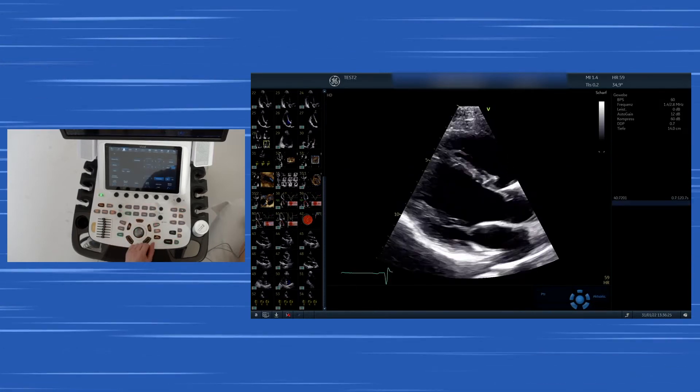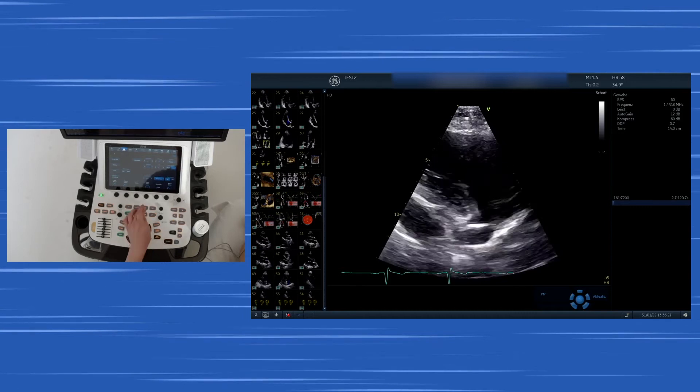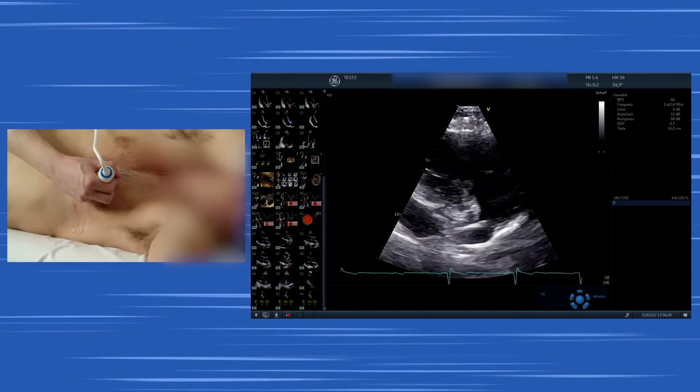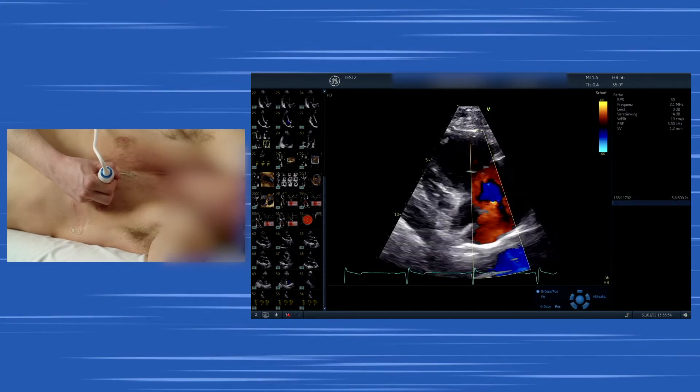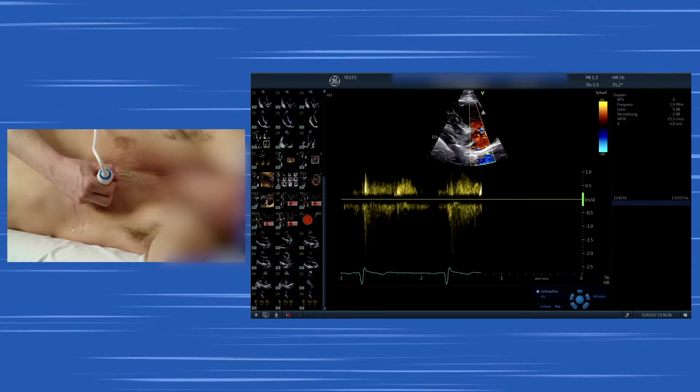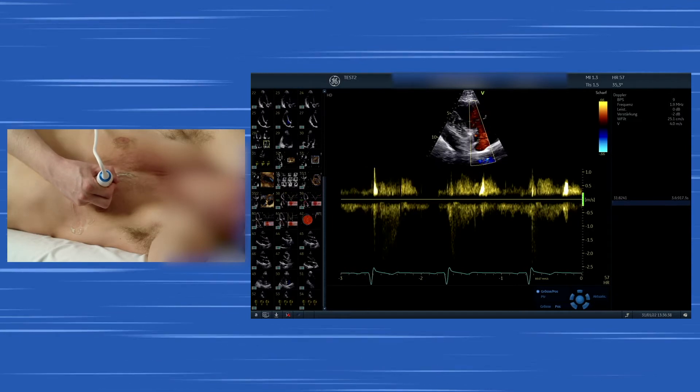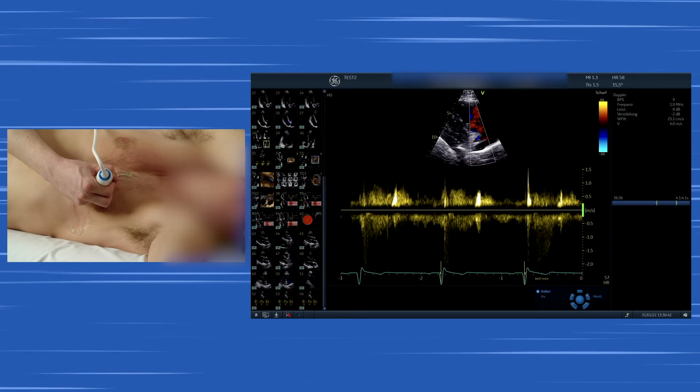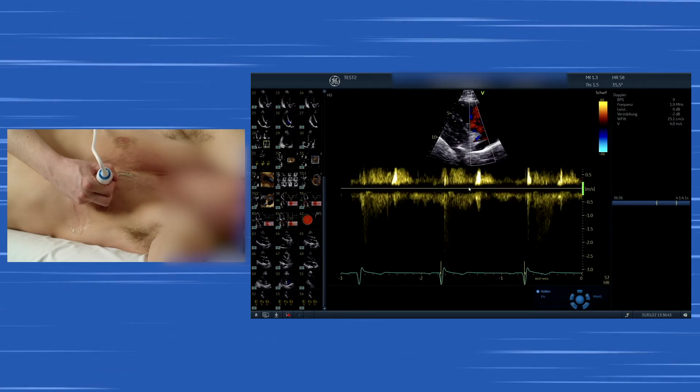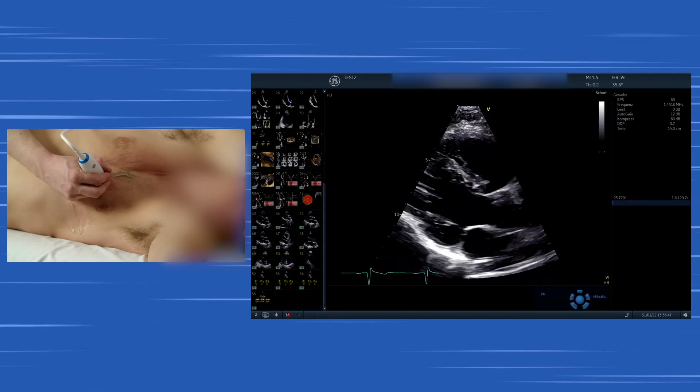Going back to tilting the transducer downwards, you see the right ventricle and you can start adding the color Doppler. You see the right ventricle in the top of the screen, the right atrium at the bottom of the screen, and you can activate the continuous wave Doppler where you can measure tricuspid regurgitation. As it doesn't have large tricuspid regurgitation, you cannot measure it here.